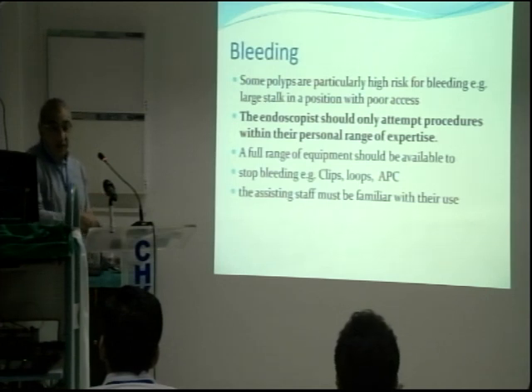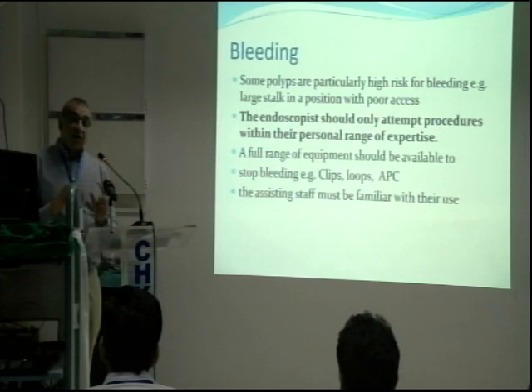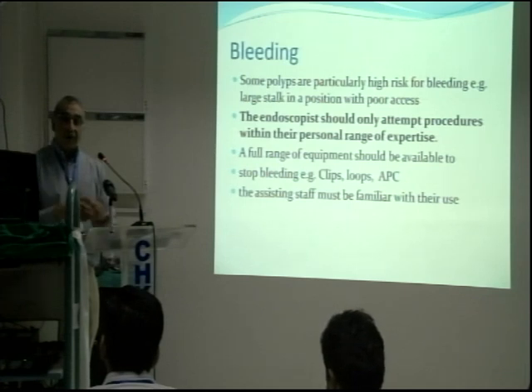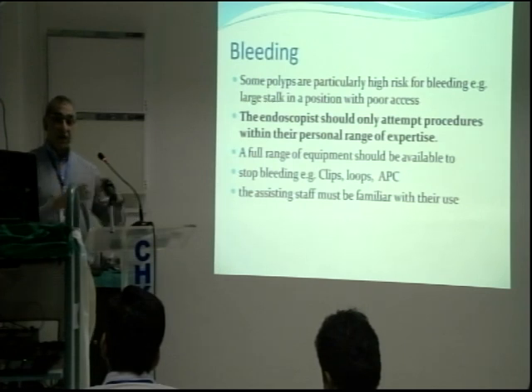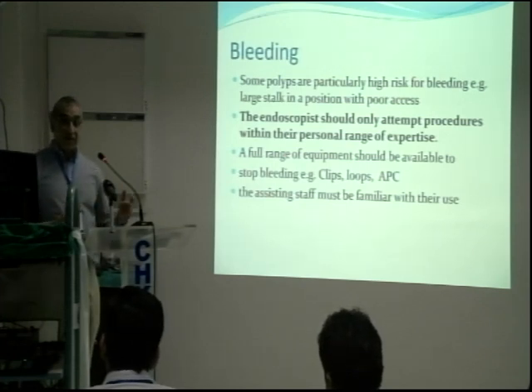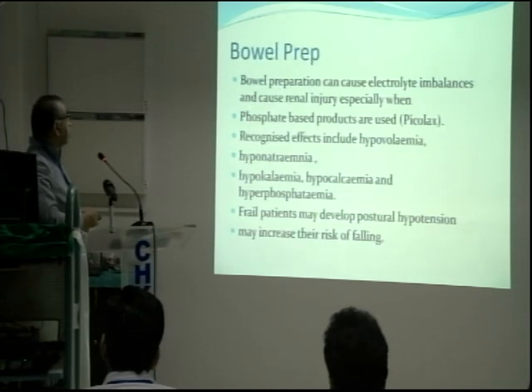Normally, in our department, because certain things like loops are rarely applied, the nurses who assist us are not familiar with them most of the time. So every 6 months, we hold a training exercise, just like a military exercise. We set up workstations in which they carry out procedures which we rarely do, so that they are familiar with them in a time of emergency. Because that's the time when you need to be more fluent during these procedures.